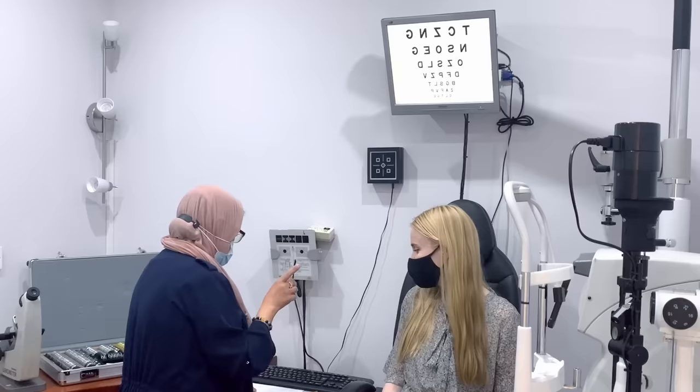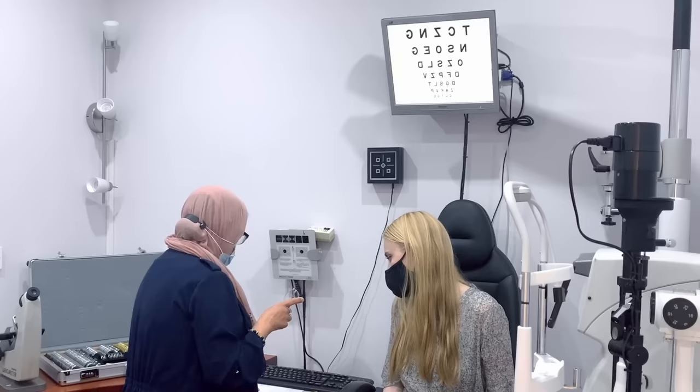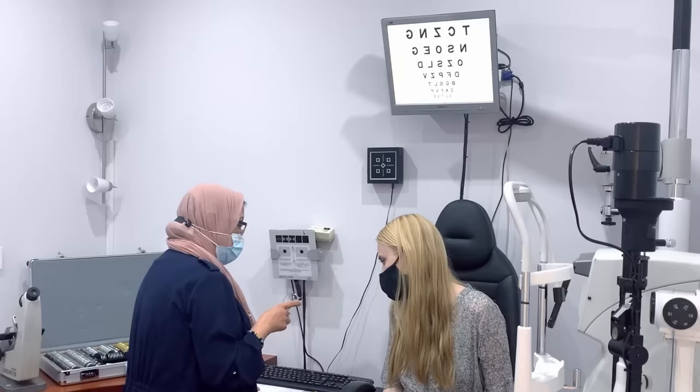But on the left eye, you're a minus 125 in your glasses. You've gone down to minus one in your left-sided prescription, yeah? Oh, okay. But you've got this slight additional lens called astigmatism. I don't know if you've heard of that word before. I believe my mum has that.